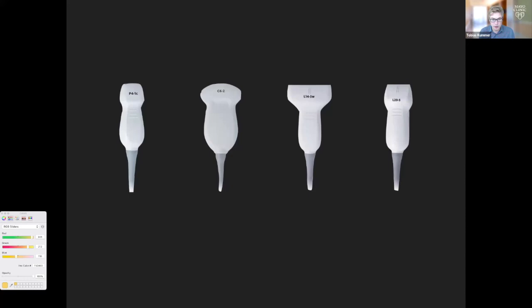What about transducers? Typically, there's a whole range of transducers. They all have to be able to scan at a fairly low frequency, which has to do with the resonance frequency of the bubble, which is about 3 to 5 megahertz or less than 5. So all of these you would scan on a very low frequency, but potentially you can scan from a phased array, curvilinear array to linear array. Obviously for FAST, most people would do the curvilinear array.